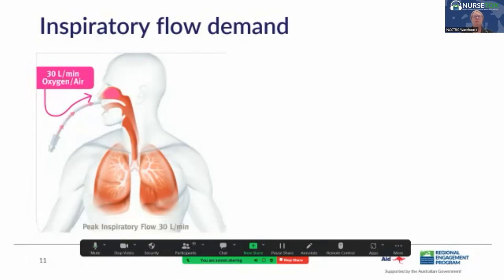All right. But the good thing about the high flow machine is that inside there's like a turbine, and that turbine pulls in room air. All right.